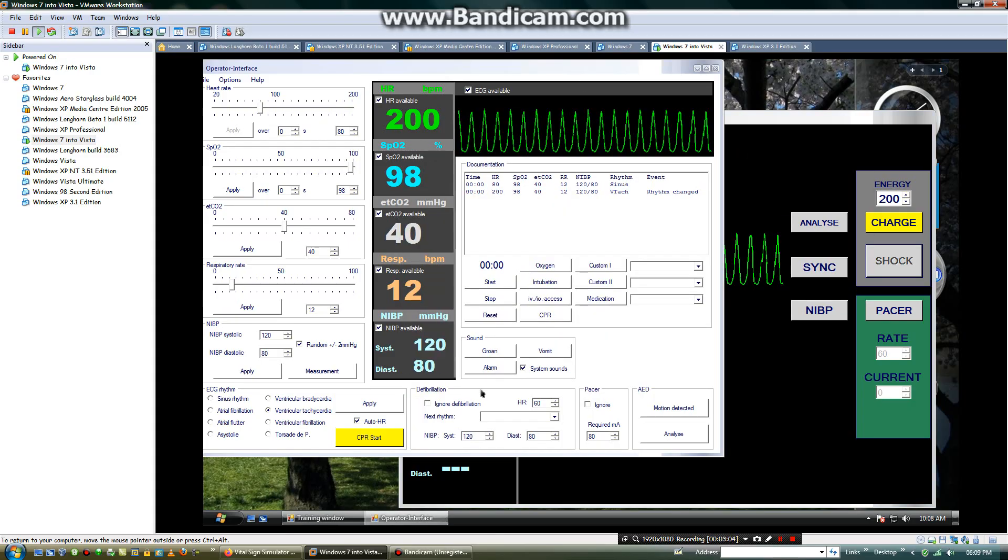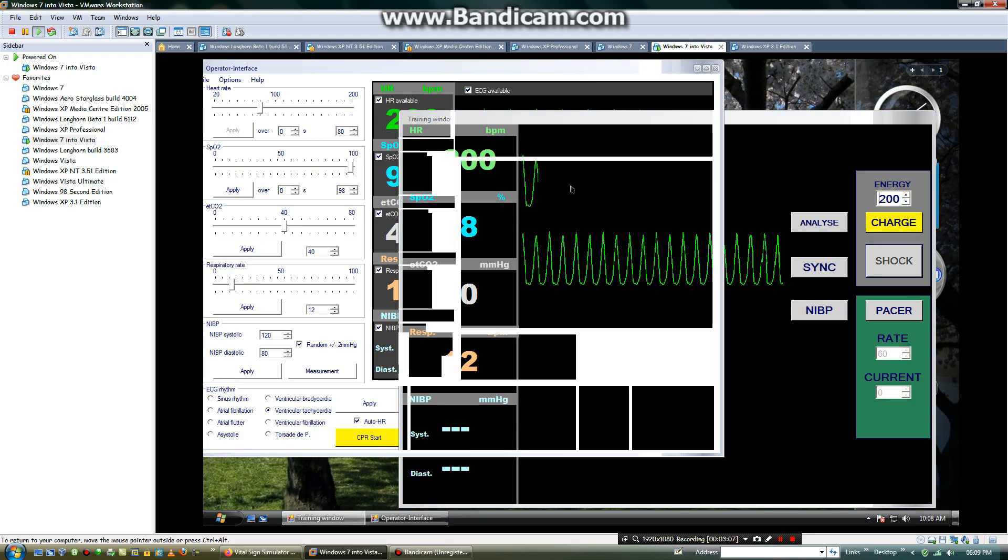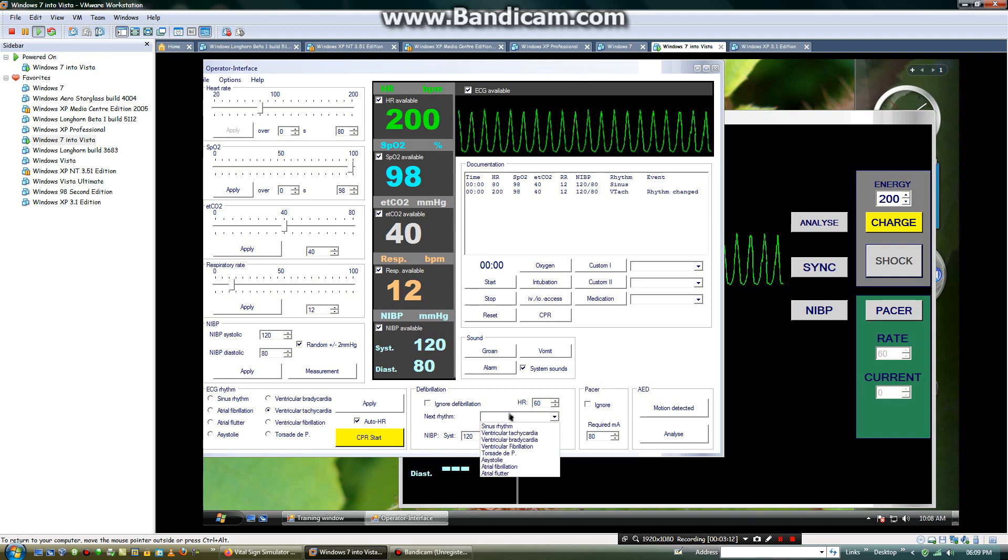Next, you will defibrillate the heart rhythm. In the next rhythm drop down, I will select sinus rhythm.